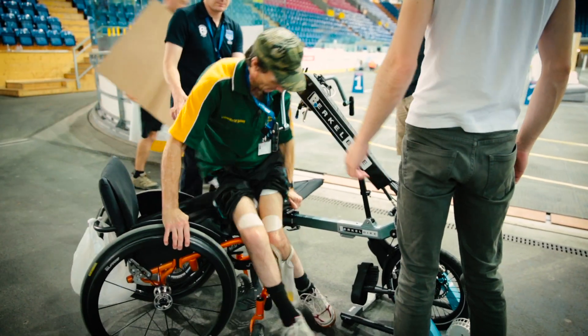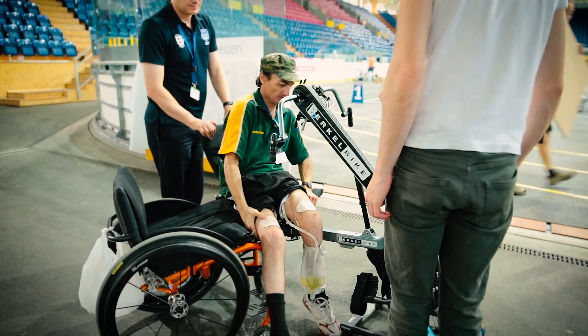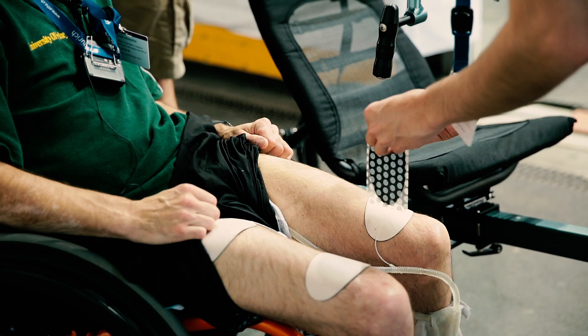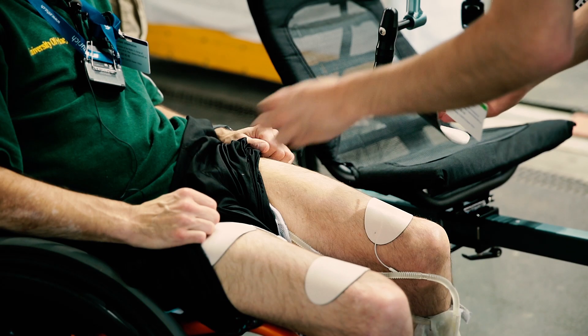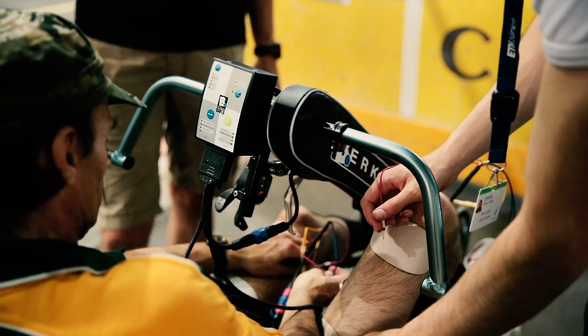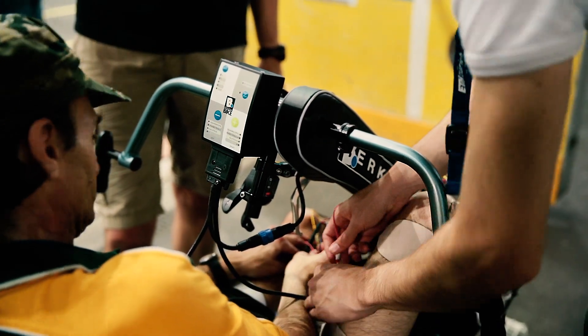One, two, three. A lot easier to get in this one than the others. The FES works with the current electrical stimulation that goes through the wires onto the electrodes placed on the muscles of the legs, and that gets your legs to pedal the trike.